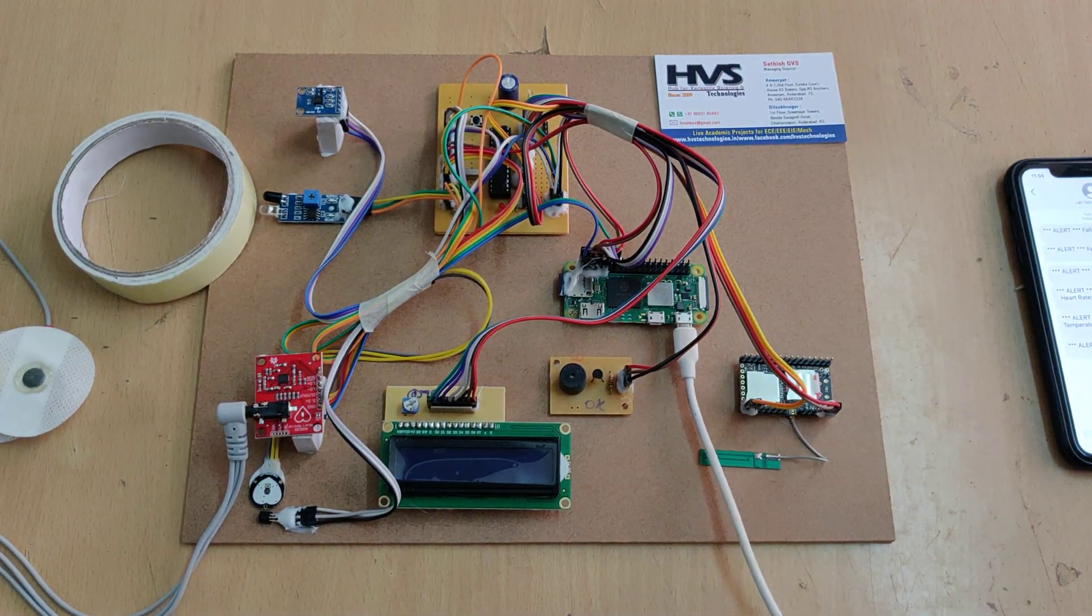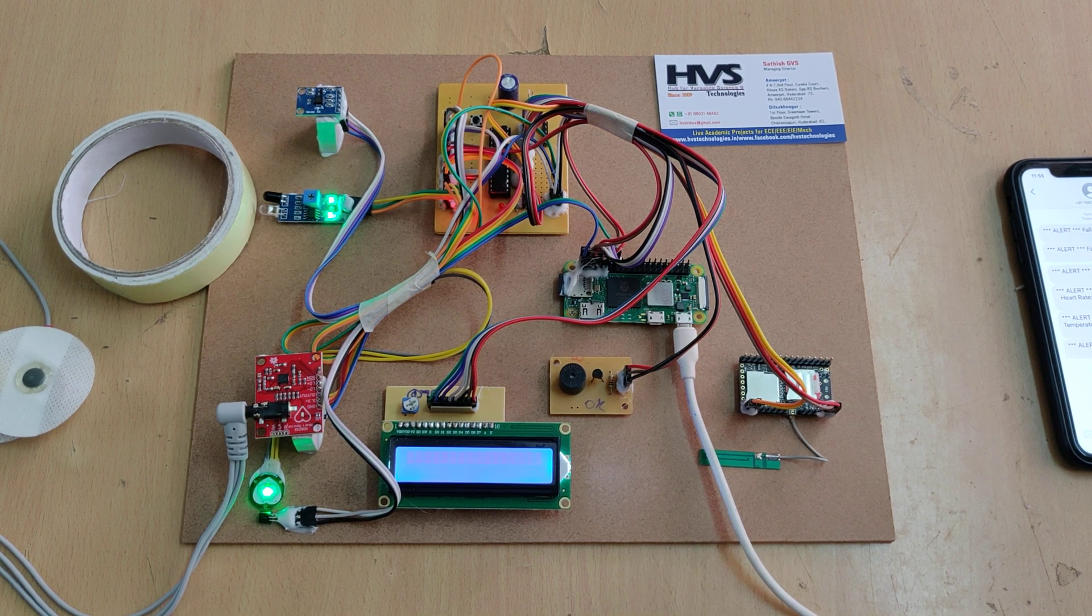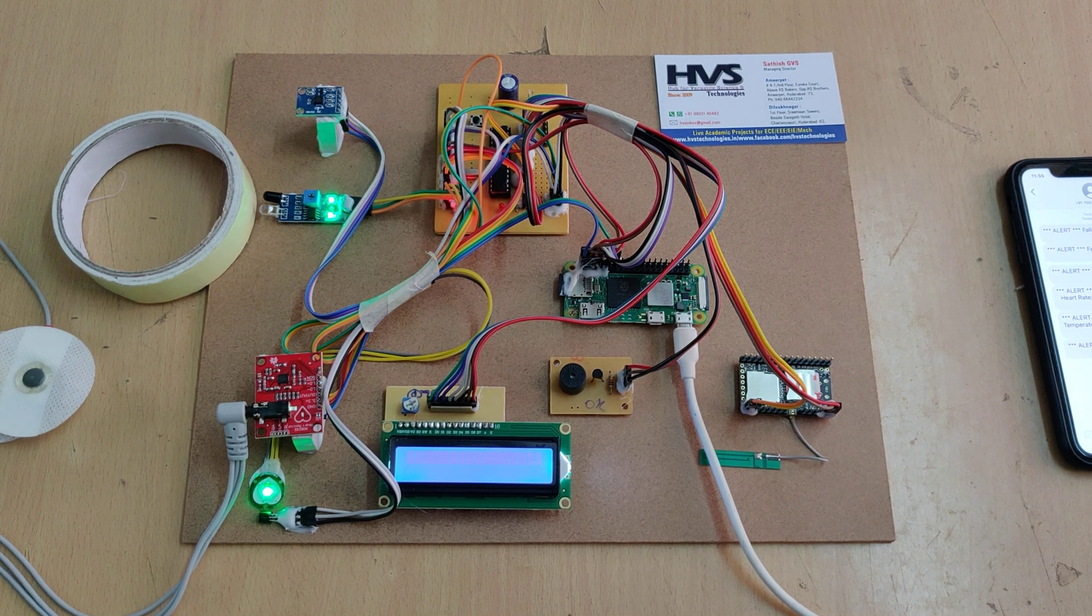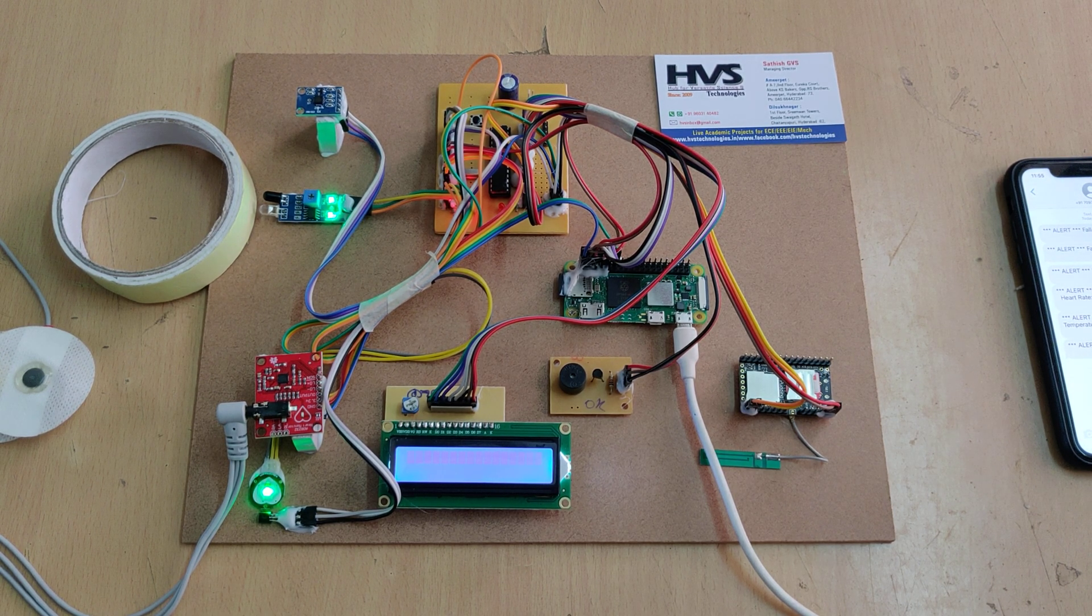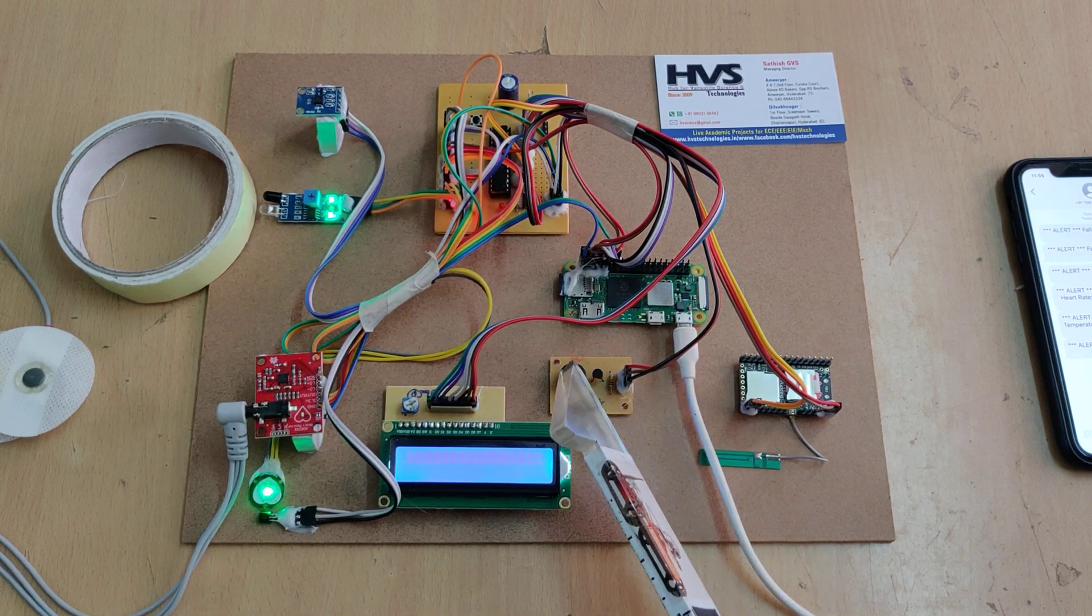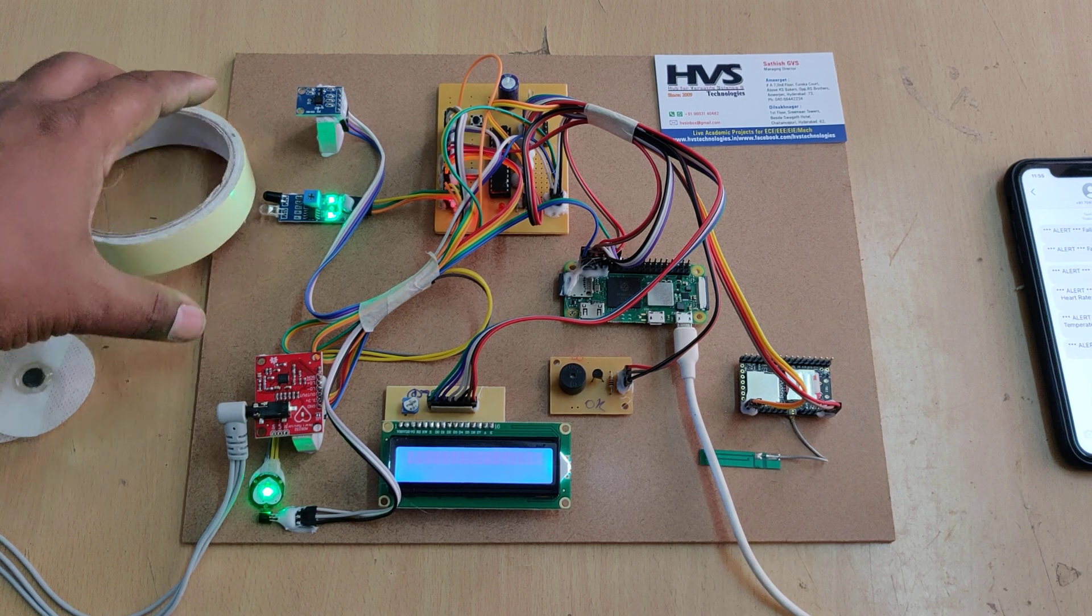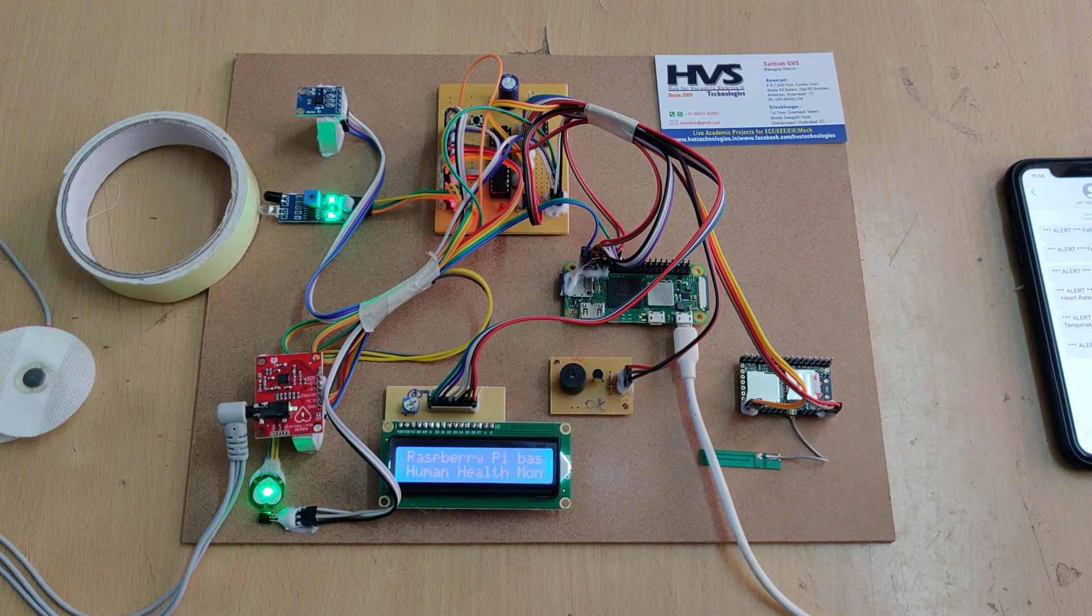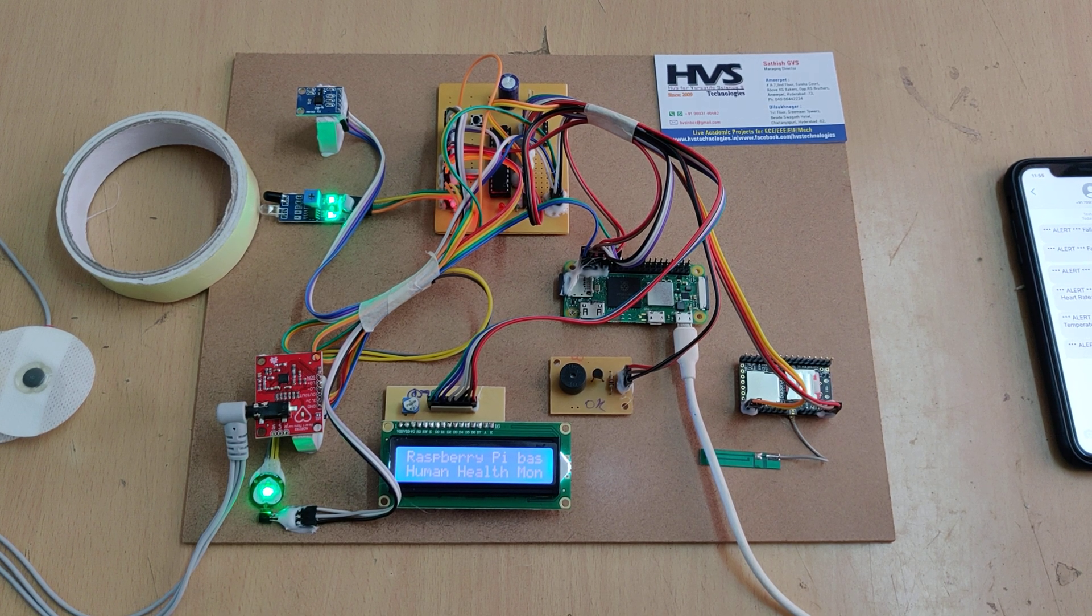Initially the system takes 15 to 20 seconds for booting time because the Raspberry Pi needs to load the OS. On successful loading, the system displays the welcome message on the LCD screen and the buzzer turns on and off twice. Place an object in front of the IR sensor to indicate the saline bottle is full.